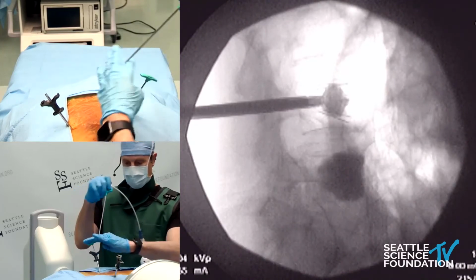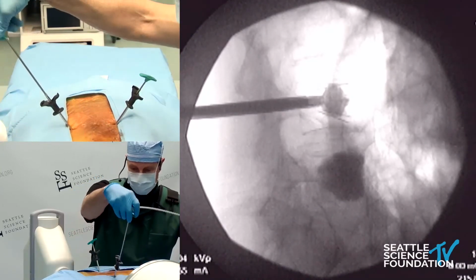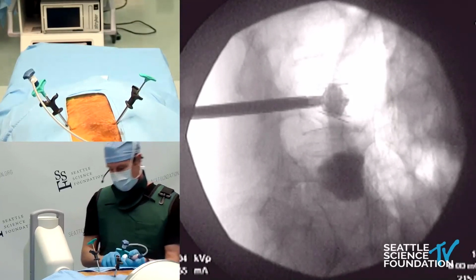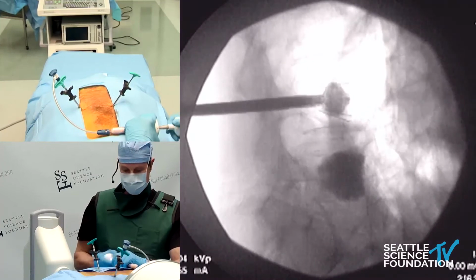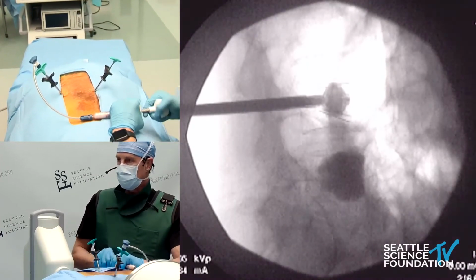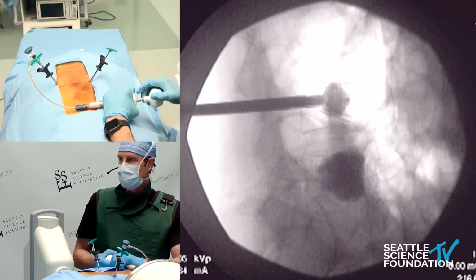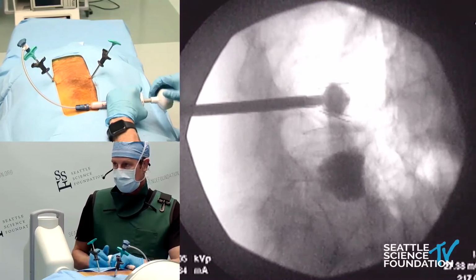And the Striker HV cement has a viscosity of about 250 to 300 Pascal seconds. This stuff is very viscous, purposely so, hence the name HV, right, for high viscosity. So you can see it duplicating that pattern on the other side.